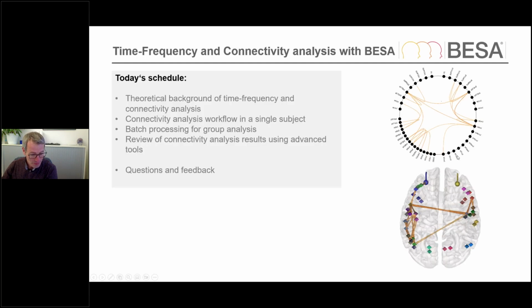The schedule for today looks like this. First of all, we will walk through a bit of theoretical background of time frequency and connectivity analysis. I will then venture into an actual case of connectivity analysis, first for the case of a single subject, and then also looking at how to approach the analysis of a group of subjects using Besa tools.